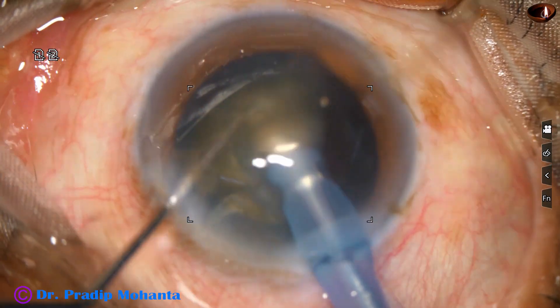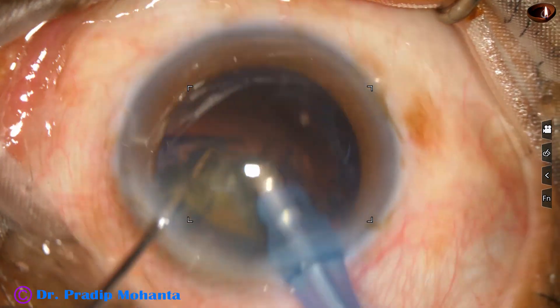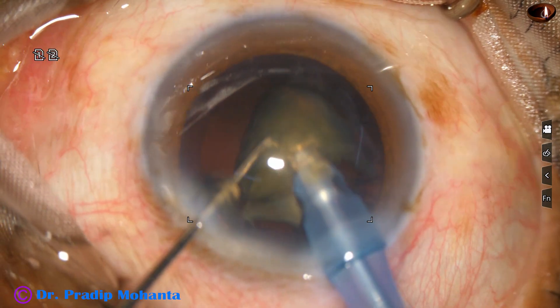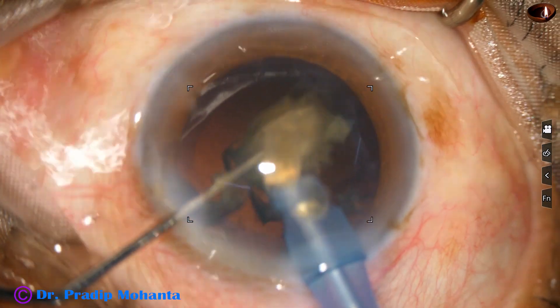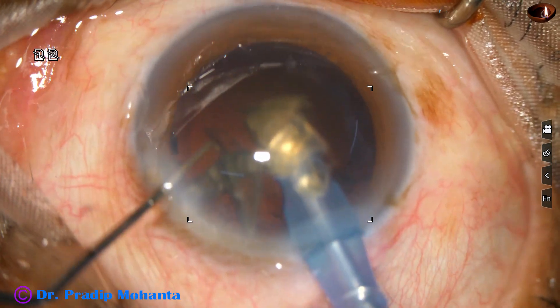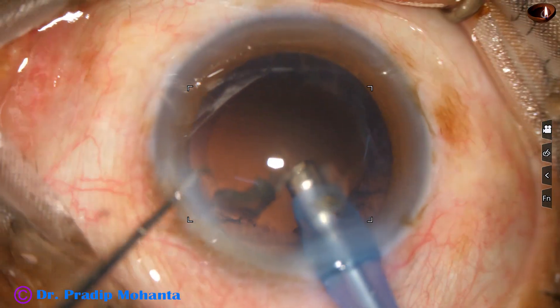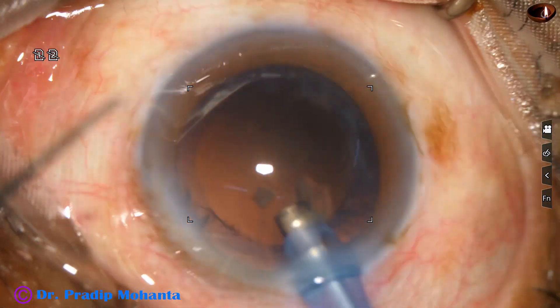Phaco energy used in this case is 80%. Flow rate is 45 ml per minute. Vacuum is 450 mmHg. But during emulsification of the last piece, I usually go to Phaco 3 mode nowadays, where the vacuum is 250, flow rate is 25, and ultrasonic energy is 65%. It is done. So the nucleus has been managed very nicely.